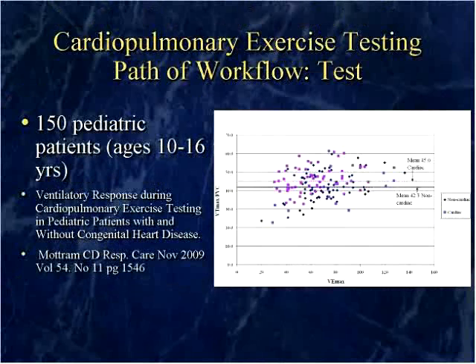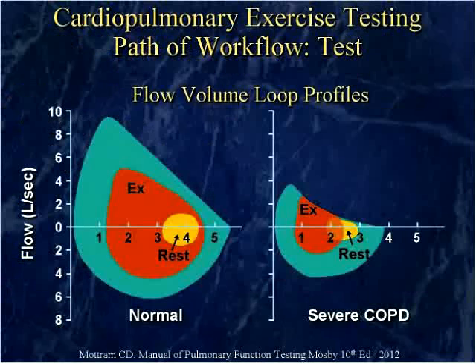This same breathing strategy is apparent in the pediatric population also. This is a document we published in Respiratory Care as an abstract and presented at the AARC forums on the pediatric response during exercise, and they also, whether they be a cardiac patient or a non-cardiac patient, use about 45 to 50% of their vital capacity during exercise. And these are all important things to know because it can help you when you're coaching the subject.